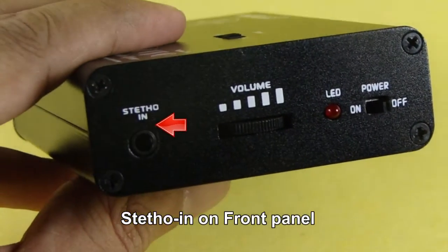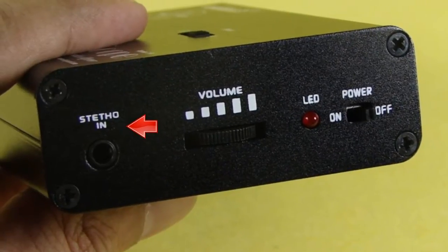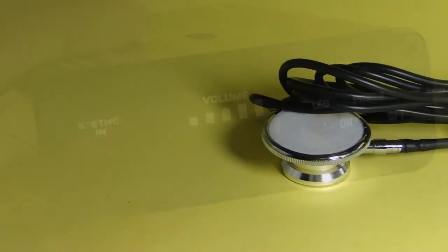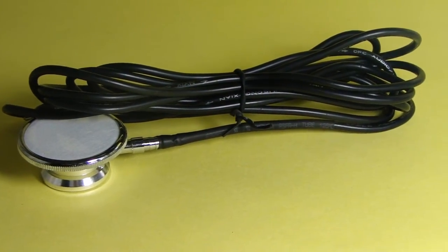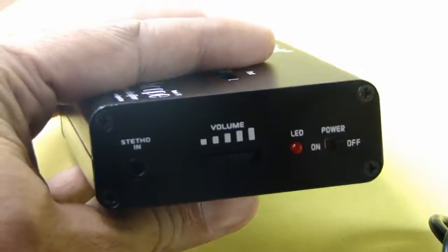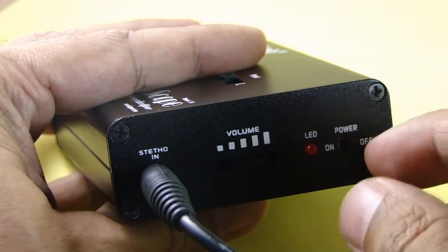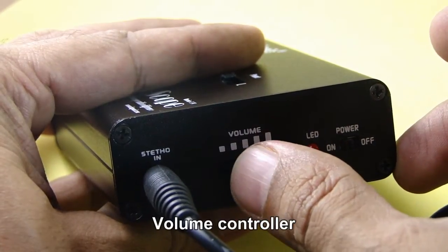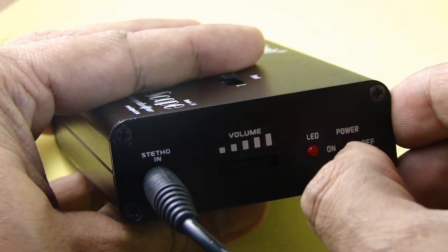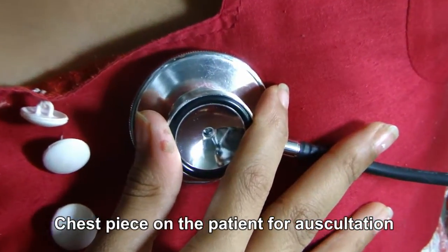Now let us make connections. This is the main unit, where you have to connect the digital stetho chest piece. The digital stetho chest piece is 3 meters long for distantly seated patient examination. Take the 3.5 millimeter jack of the digital chest piece and insert it into the stetho-in port on the front panel. On this front panel you also have the on/off button and the volume controller for controlling the sound of intrabody sounds as you listen to them. This chest piece now goes onto the patient for auscultation.